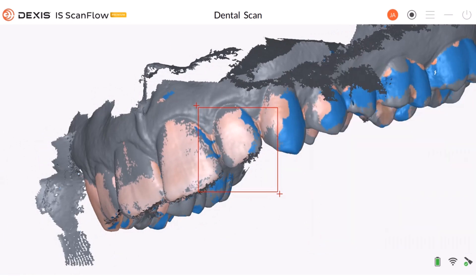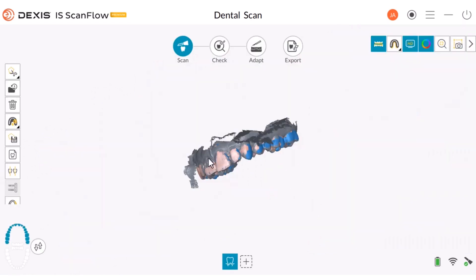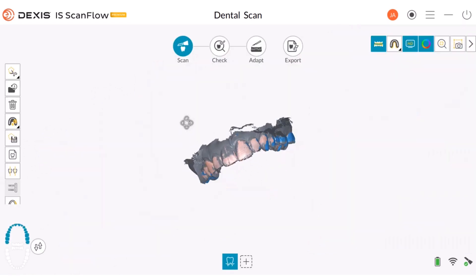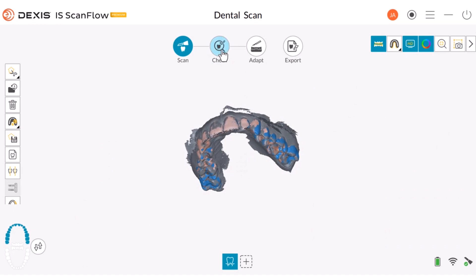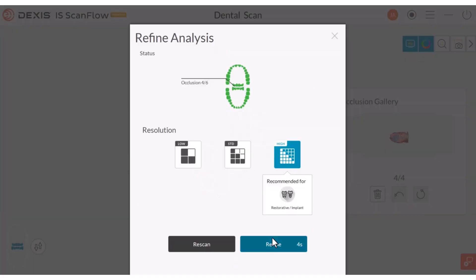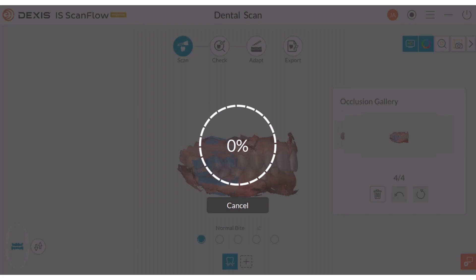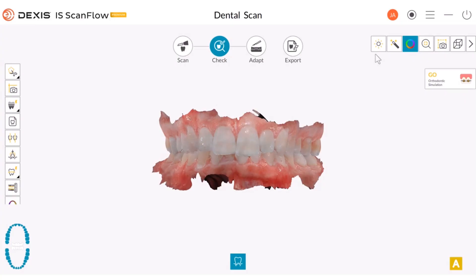Once you have finished scanning the teeth, go to your check tool and refine the image. Once your image is refined, come over to the left side and select your shade matching tool.